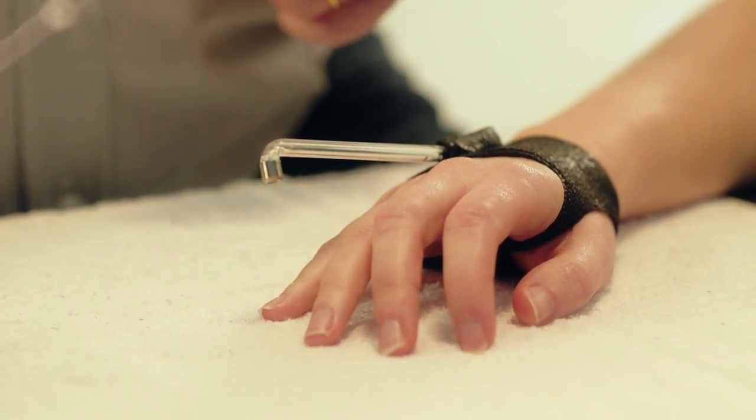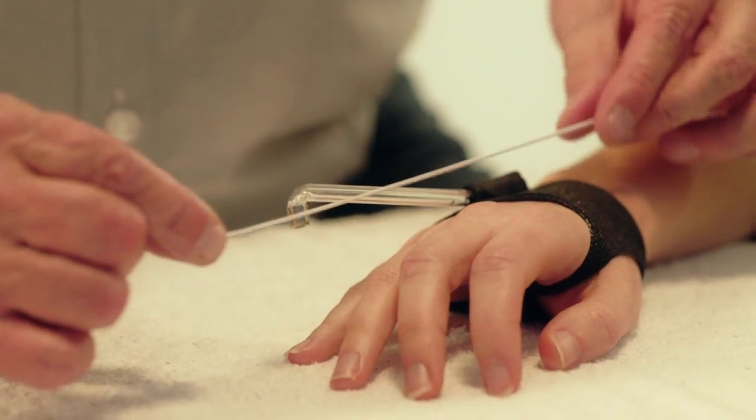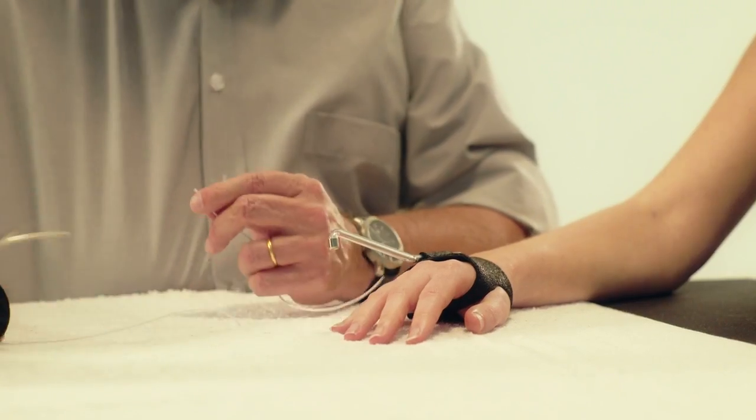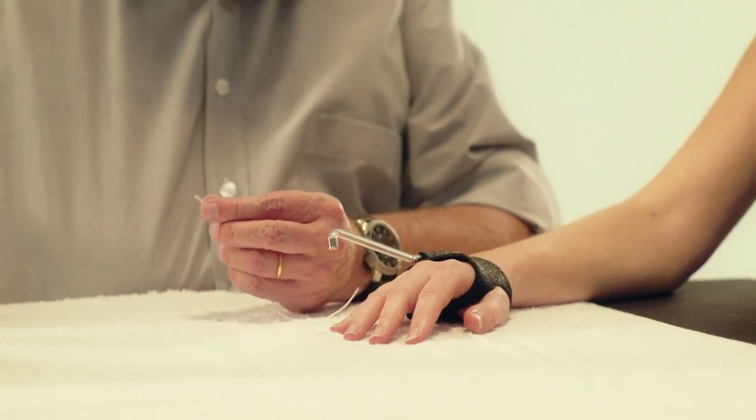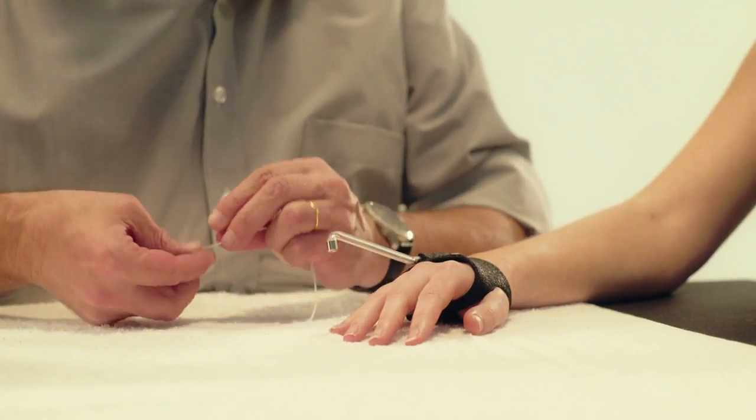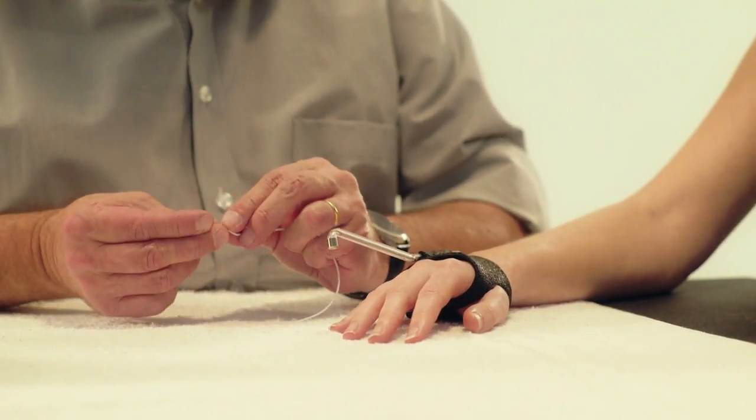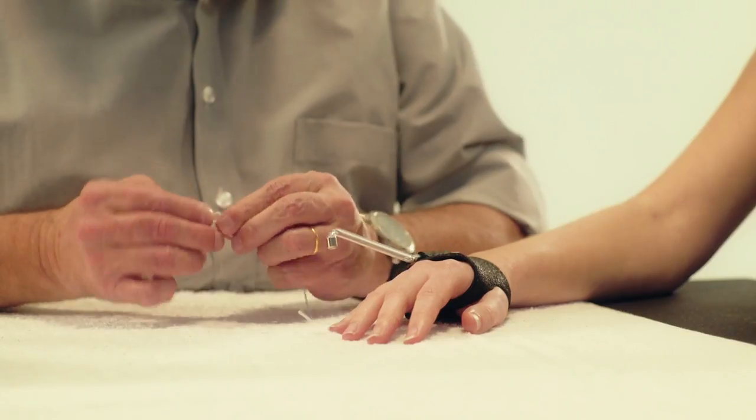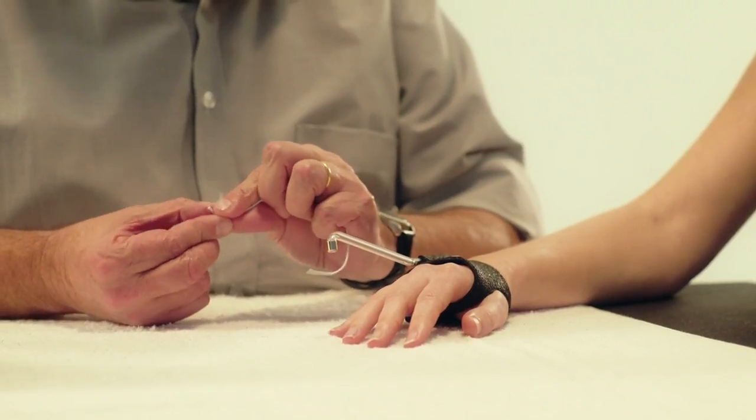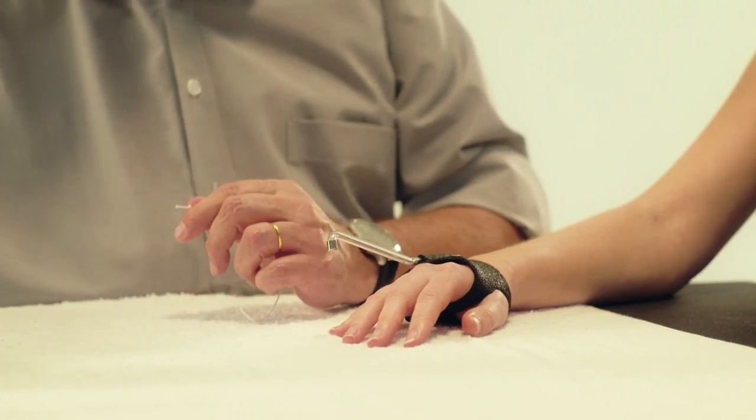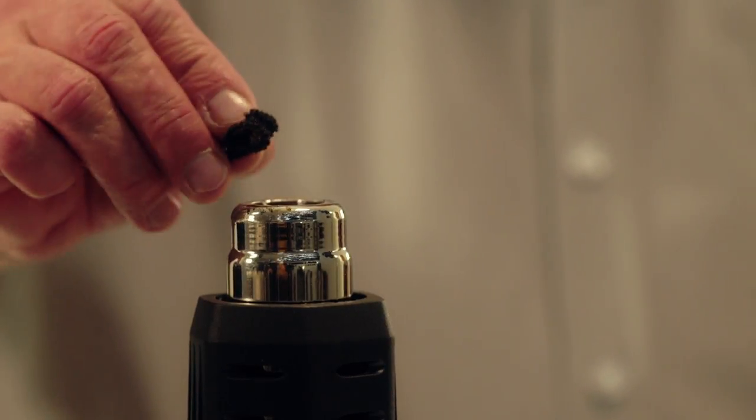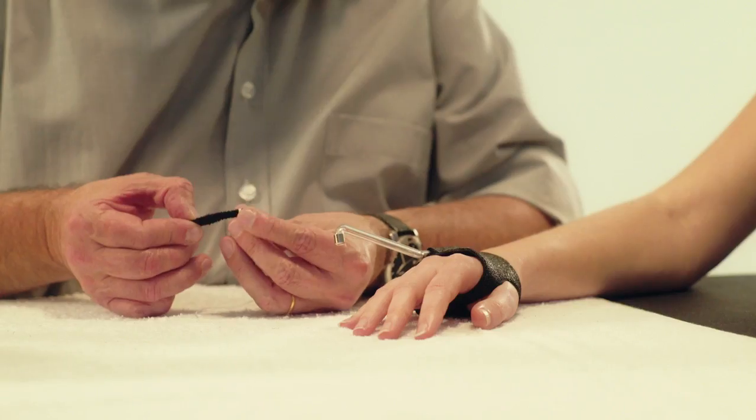Thread the Orphi tube with elastic thread. Make a noose at one end of the elastic thread and secure it by heating some OrphiCast and wrapping it around the noose.